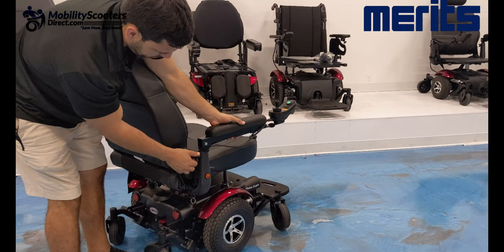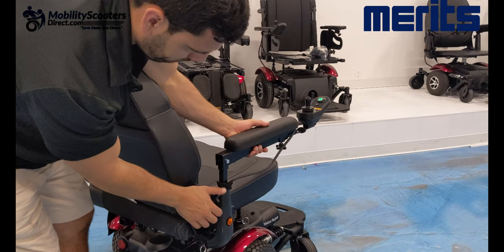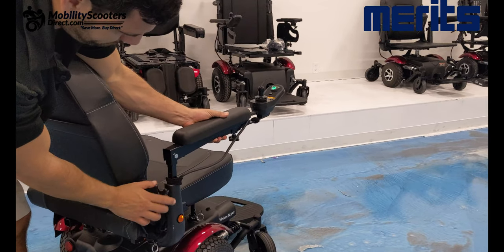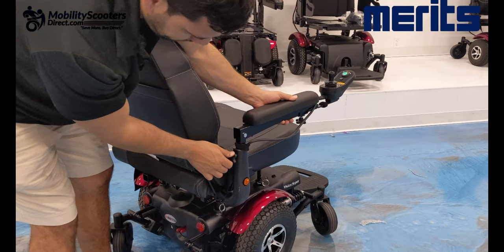We're going to demonstrate that the armrests are height adjustable. There are tension knobs on the rear of each armrest — simply loosen them and then lower or raise the armrests to the desired comfort level for you or the intended user.